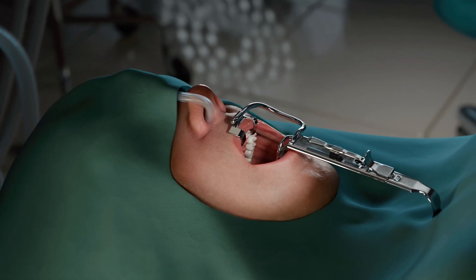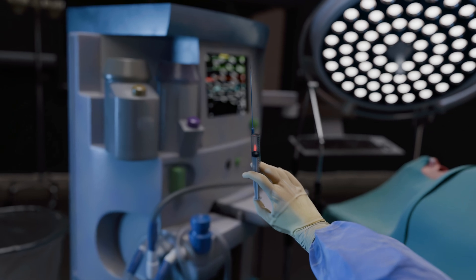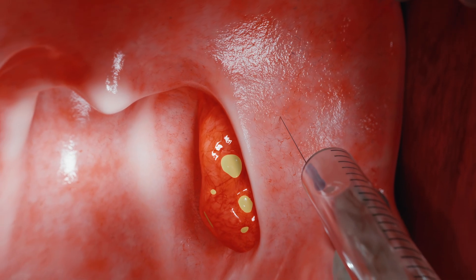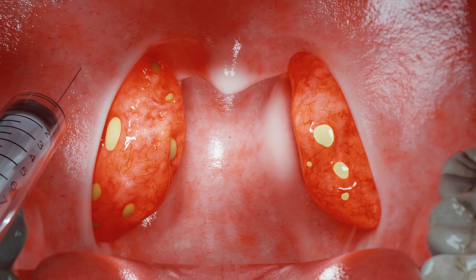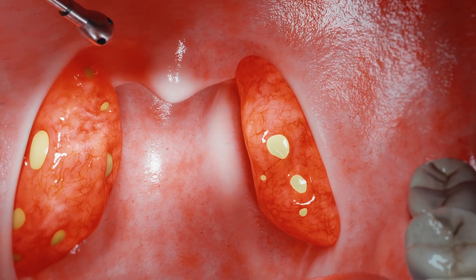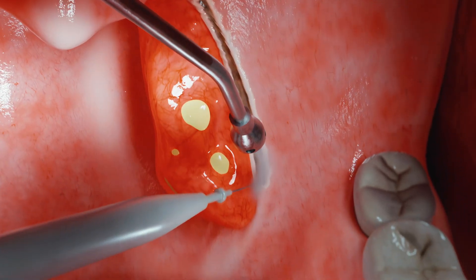After access to the oropharynx is achieved and the mouth is opened using a mouth gag, the tonsil is dissected along its capsule. Bipolar coagulating scissors are employed, allowing for simultaneous tissue dissection and vessel coagulation, thereby reducing blood loss and improving visibility.